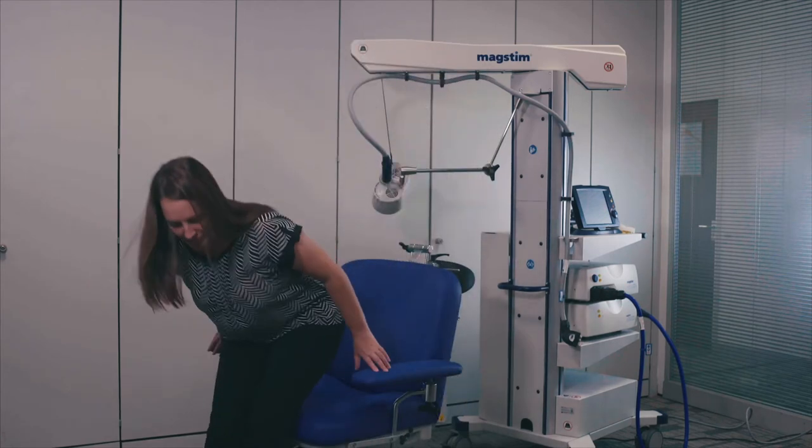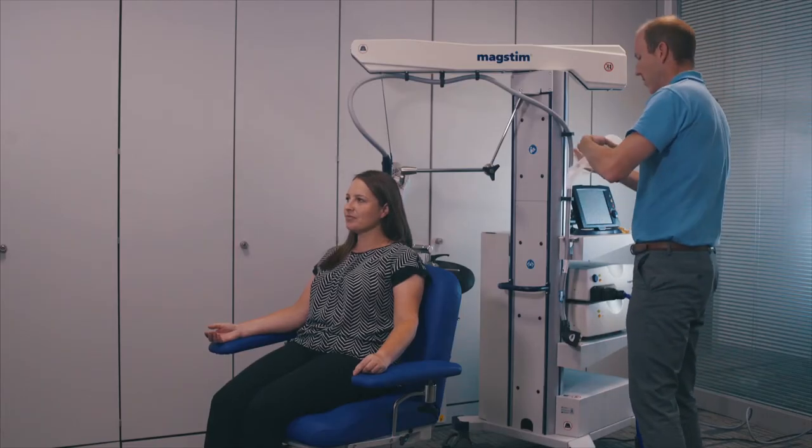The patient should sit in the chair in an upright position with their right arm resting on the armrest, palm facing up. Ensure the patient is comfortable and the arm is relaxed.